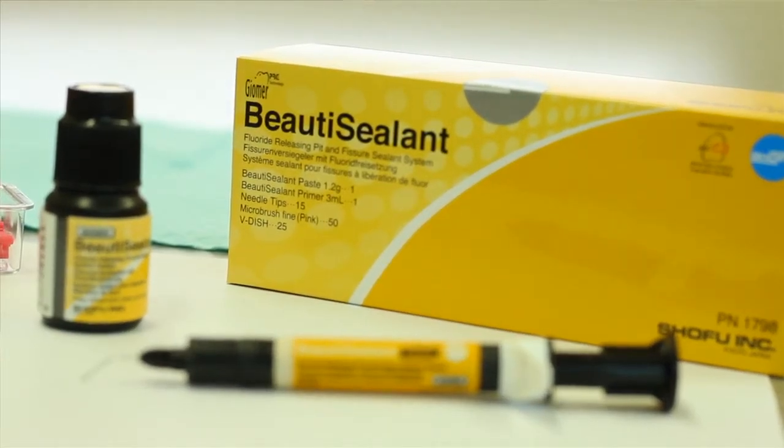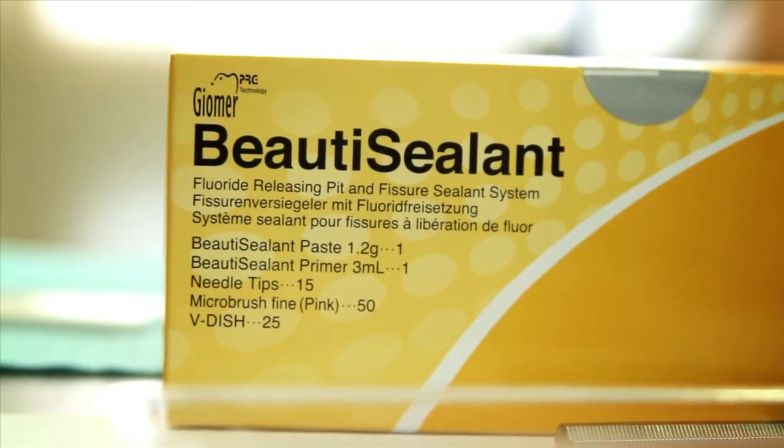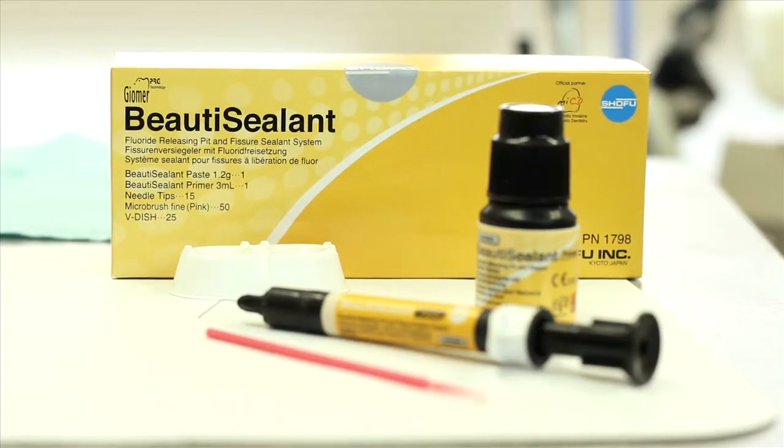Beauty Sealant is a pit and fissure sealant that does not require an etch or a rinse step, which makes it more pleasant for the patient and a little more productive for the practice. Beauty Sealant is a fluoride releasing and recharging pit and fissure sealant that uses a primer and does not require phosphoric acid etching.